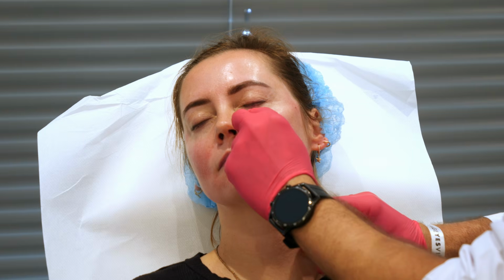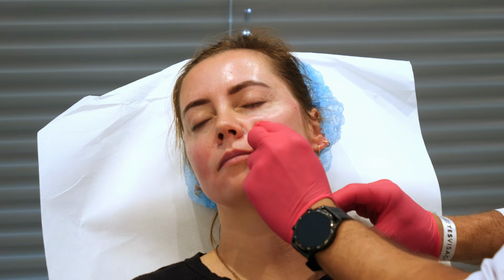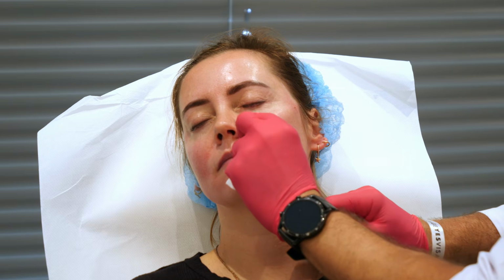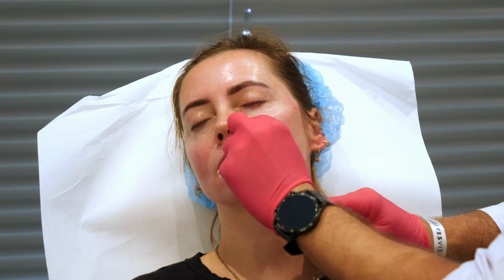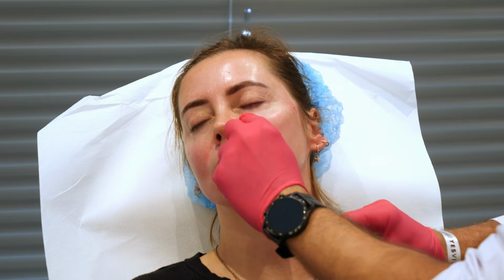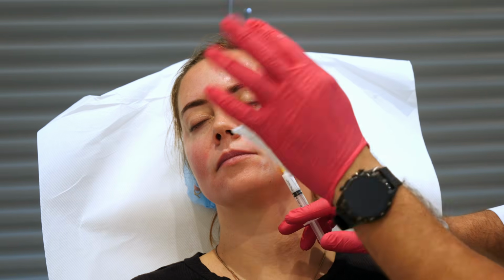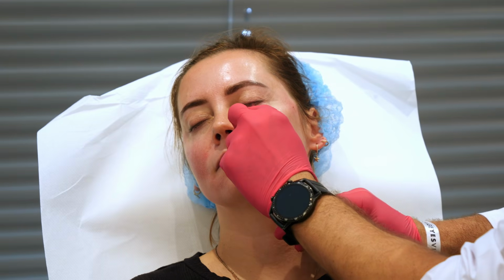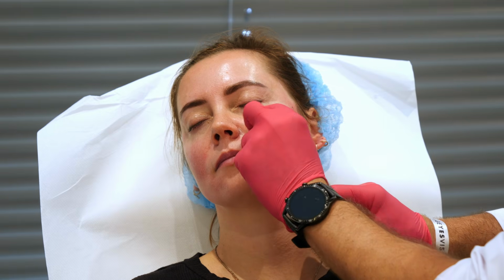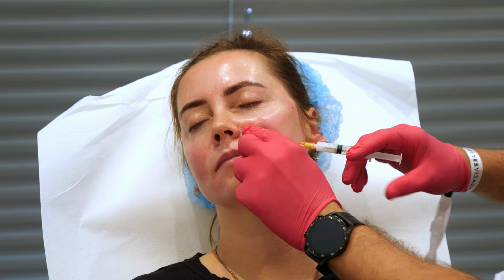You can put with another dilution a little bit of product in the lacrimal surface, because it's a very secure product, but in a more diluted form, about 6 milliliters of water for injection and 2 milliliters of lidocaine.